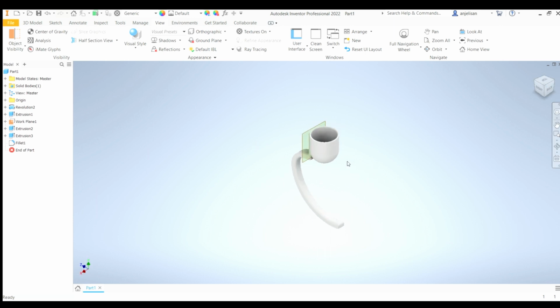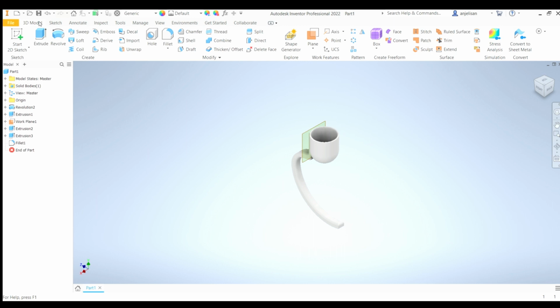So this won't be the final model. There's a lot of stuff that we could do post 3D printing. We can add foam inside the cup to make it more comfortable to wear for the person wearing it, because having your skin just be touching hard plastic all the time is, I imagine, very uncomfortable. We can also add rubber on the bottom of this foot so that there's more friction. It's easier to run and at the same time stay in place.